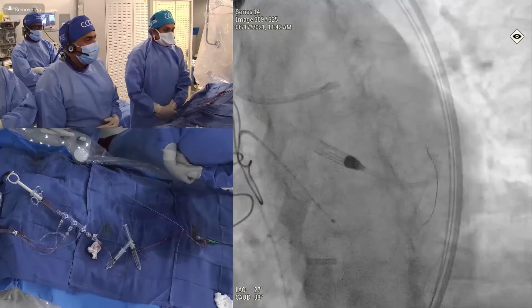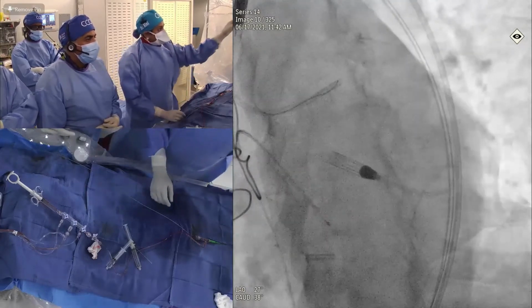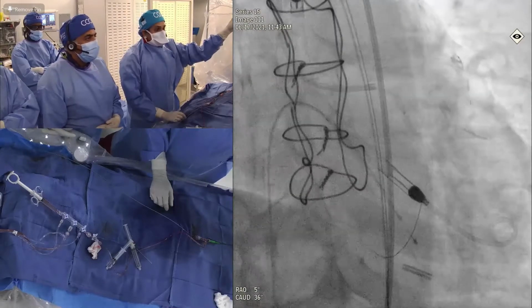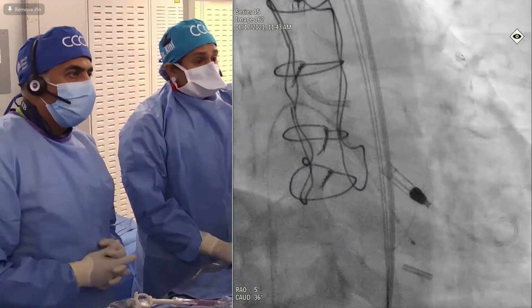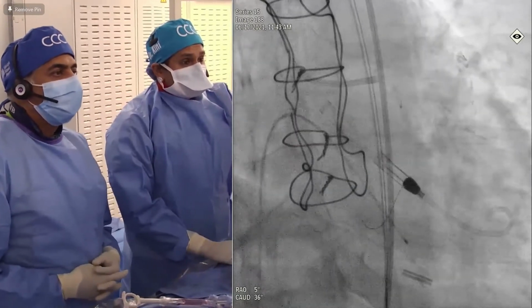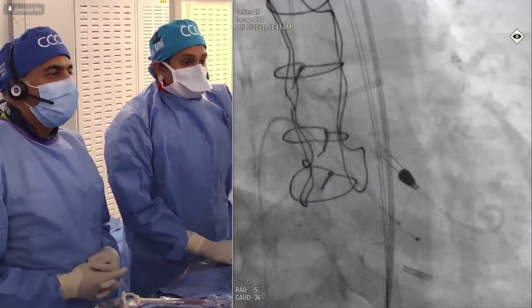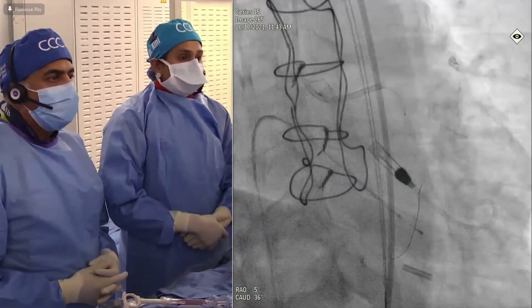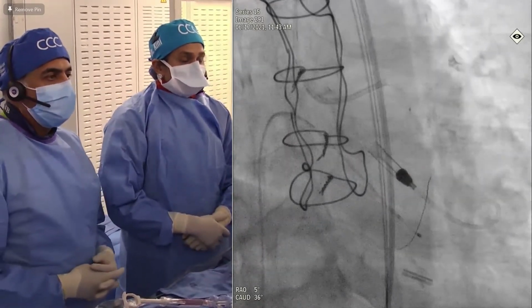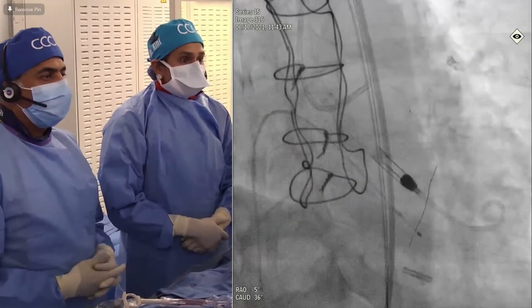Like we mentioned, the next challenging part is, can we get the Fine Cross? So this is exactly, you see that? Yep. That calcium and the angle, the Fine Cross would not go down. So what you essentially do is you twirl, rotate like you want to do with a corsair. Exactly the same movements you can see here.